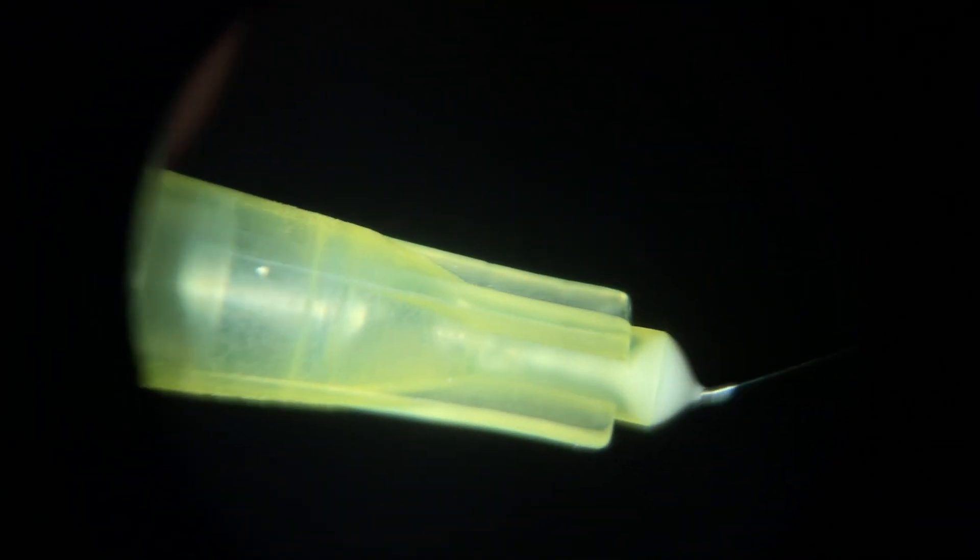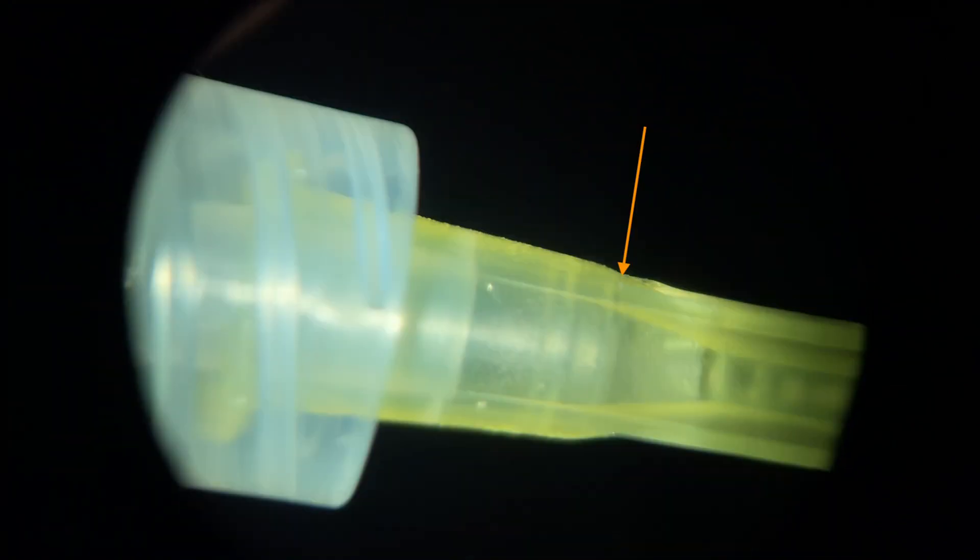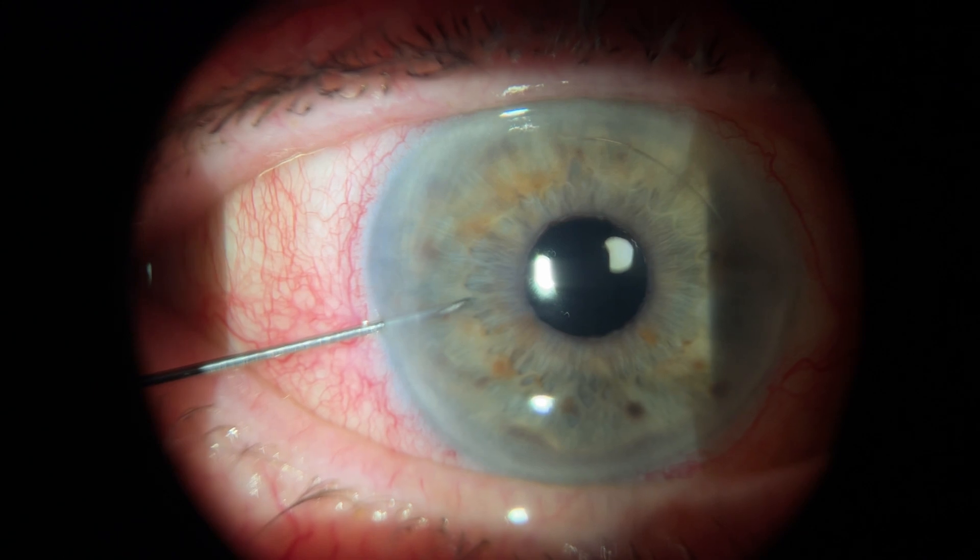As you can see, you're not taking tons of fluid out of the eye. Usually you're just filling the tip of the needle. Afterwards, measure the eye pressure to see if you have lowered it enough. If not, you can use the same needle track to enter the eye again.